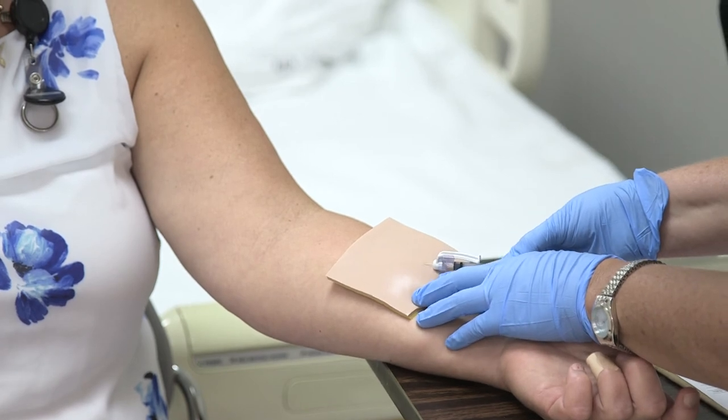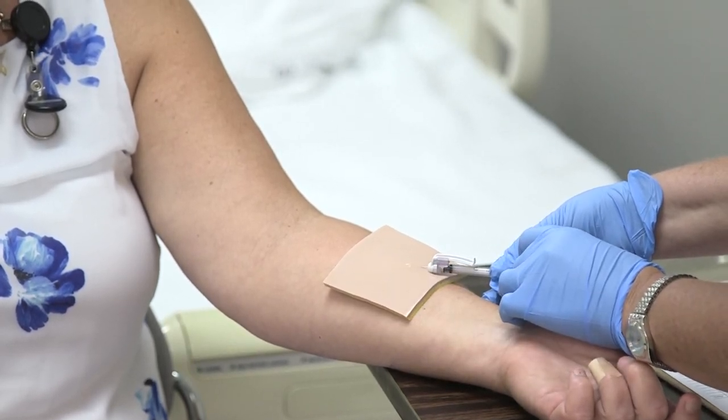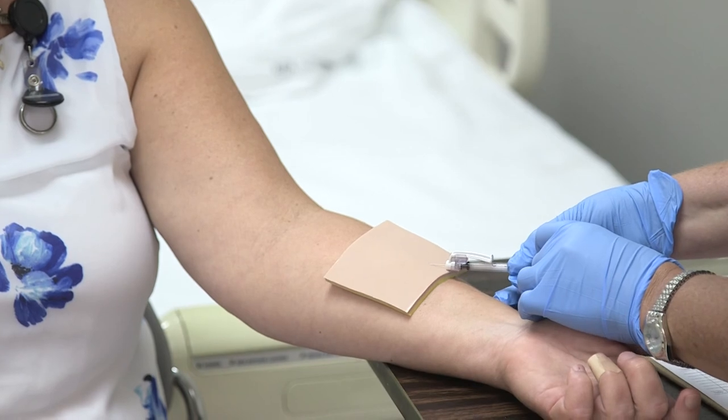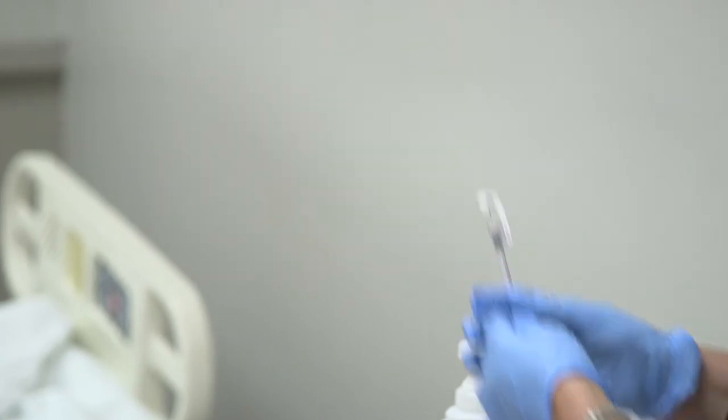Since this isn't real skin it's a little difficult, but once you're in, go ahead and inject. You should see a small bleb form. Then pull out the needle and engage the safety cap, making sure you dispose of it properly.